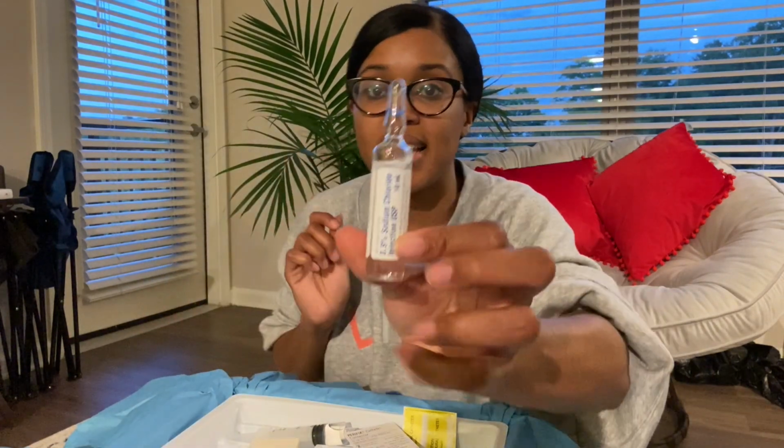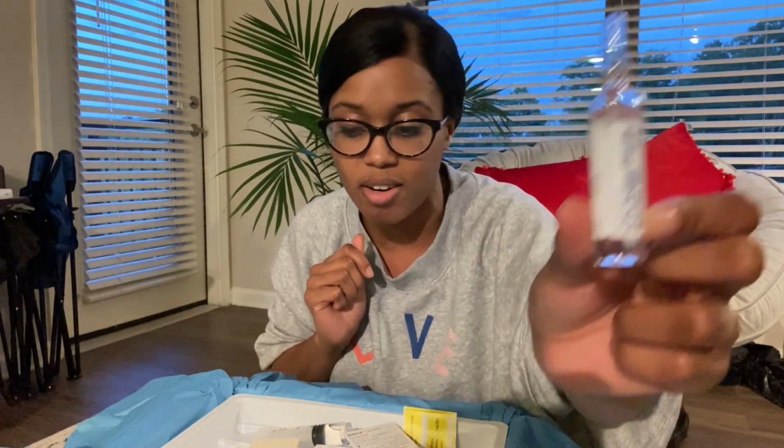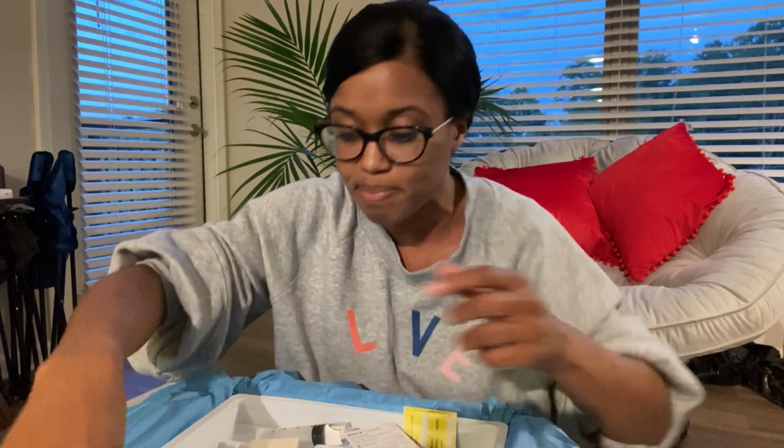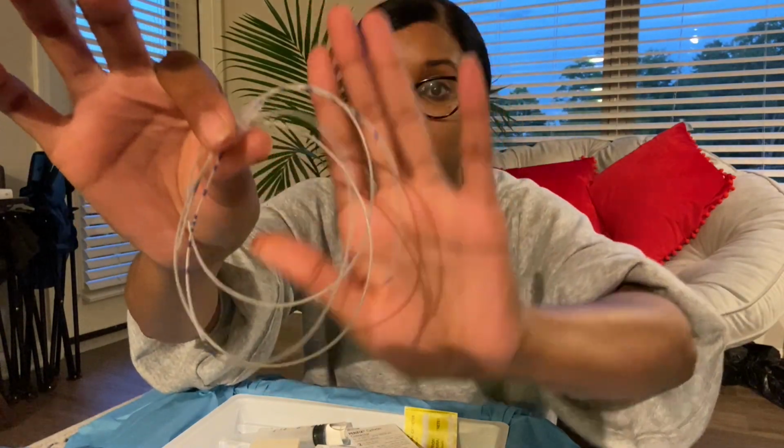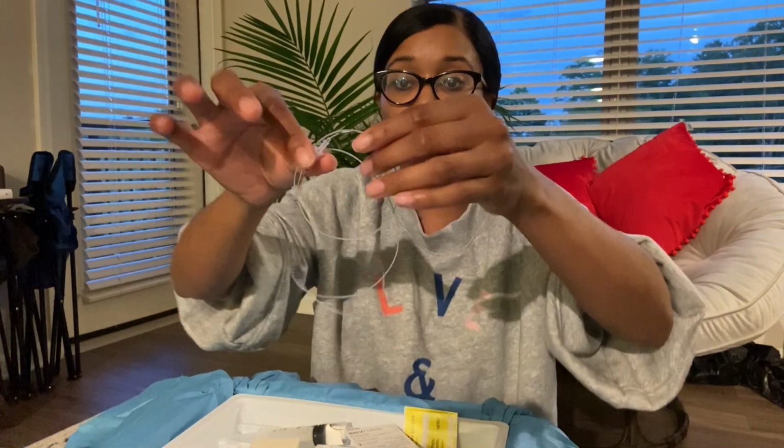And then also just saline, and this is just something we can use to test loss of resistance, and I'll talk about that in a second. Okay, and then what else do we have in here? We have the epidural catheter. So this is actually the catheter that is threaded into the epidural space of the patient, and it has different markings just so we can keep track of how far in the patient's epidural space the catheter goes.